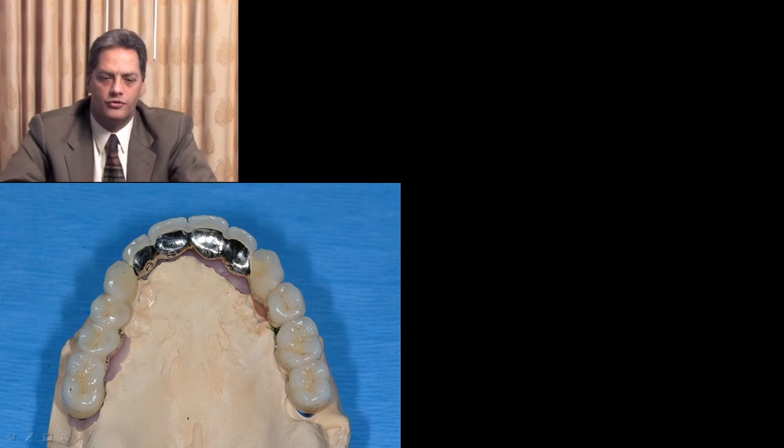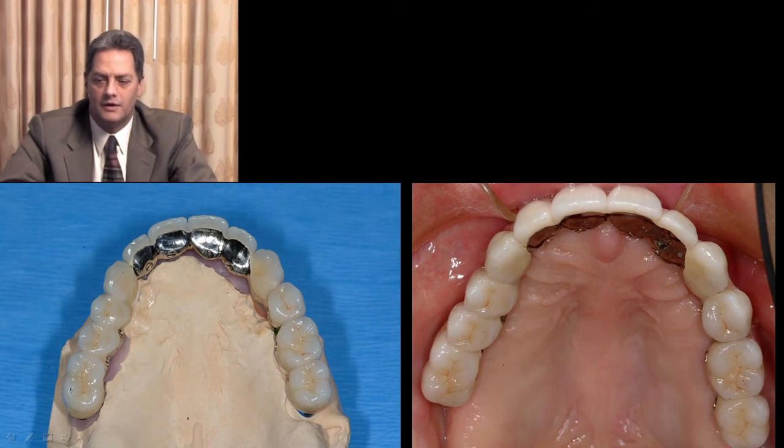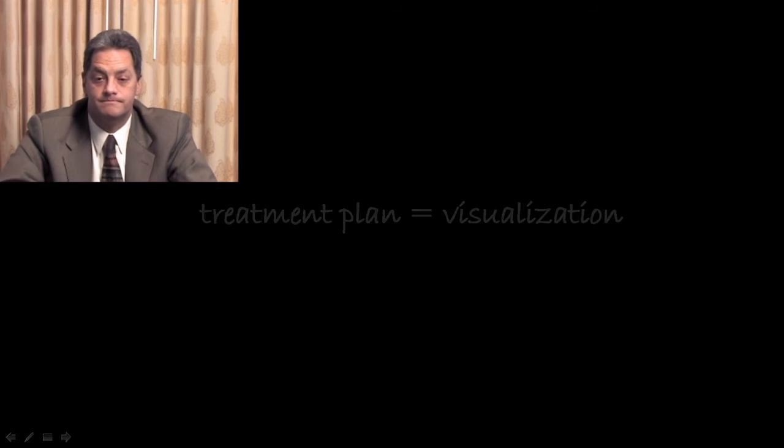So here we have an occlusal view on the model of the final prosthesis, and here we have how this was actually delivered into the patient's mouth. And all this could have been avoided with proper planning.